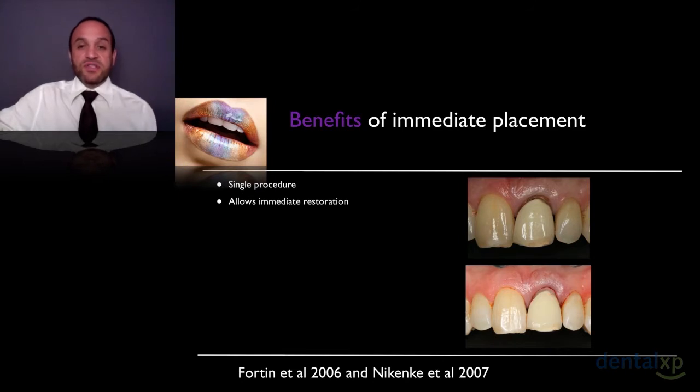And here you can see the kind of scenario whereby we've done the immediate restoration. Now, again, I said to you before that I like to put the patient's own crown back. The first thing that you might say to me is, is this guy an absolute lunatic, for the pure reason that, have you seen what the crown looks like? It looks like a dog's breakfast. There's a very good reason why I put the patient's own crown back, even if the crown doesn't look great. One of the main reasons is that if the patient has had their own crown for 20 years and you put that same crown back, when they look in the mirror and see the same crown, they think, okay, that's not a problem, it's not the permanent, but that's what I've been walking around with. So is it really a problem for them? And the answer is no.